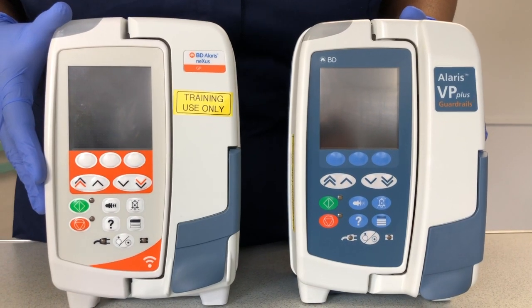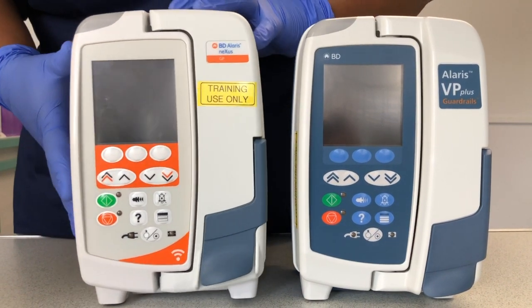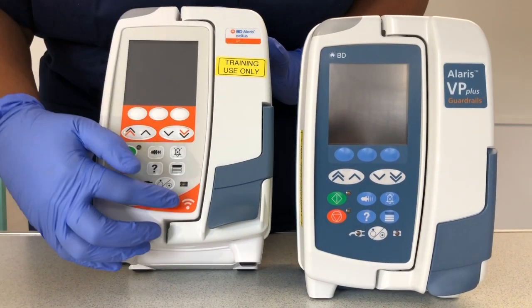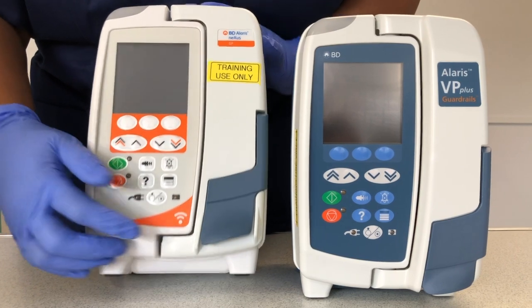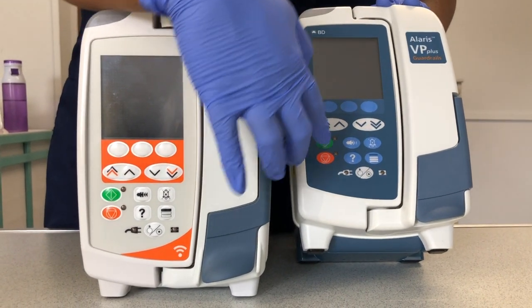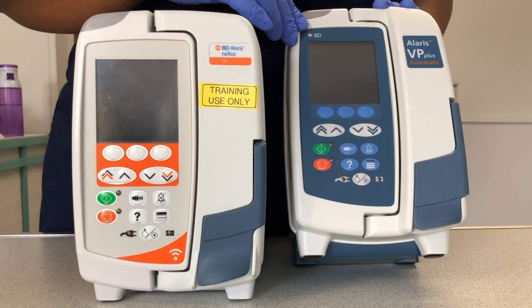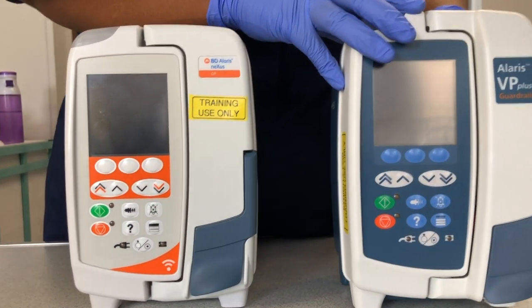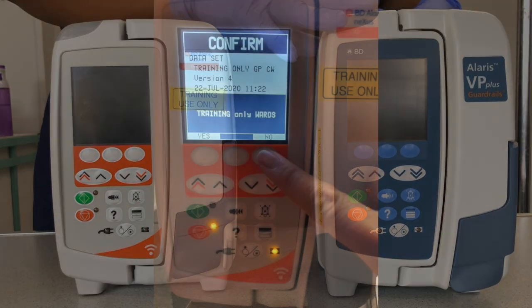These are the two volumetric pumps that we will be having in the trust. This is the GP Nexus version, which means that it is Wi-Fi enabled. And this is the VP Plus pump. It's not yet Wi-Fi enabled, but we will be getting this. Certain areas will be getting these that are using the inline pressure monitoring.